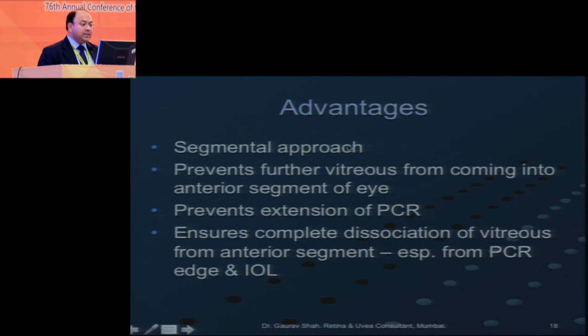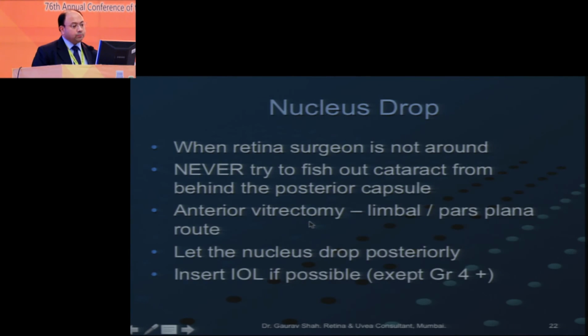So the advantages of this is that it is a segmental approach. It prevents further vitreous from coming into the anterior segment of the eye. It prevents extension of the PC rent and ensures complete dissociation of the vitreous from the anterior segment, and does not leave any vitreous tags which get entangled into the wound or the side port.